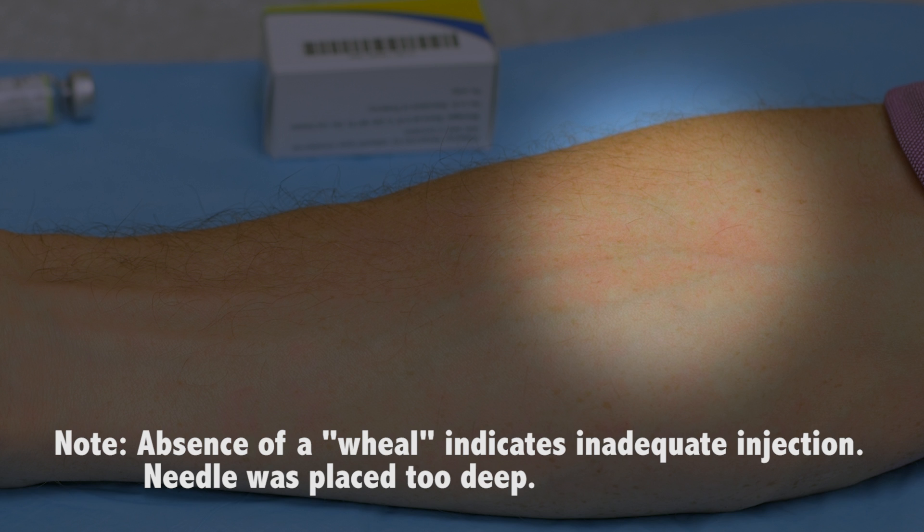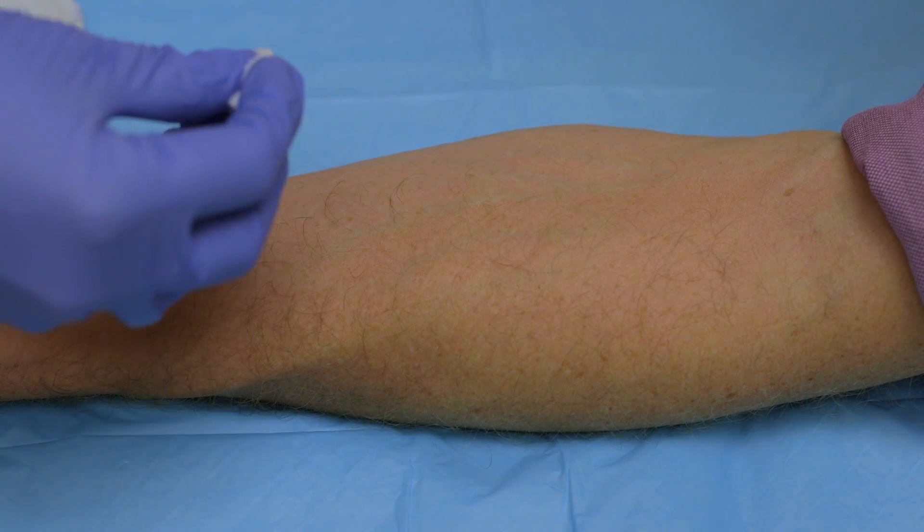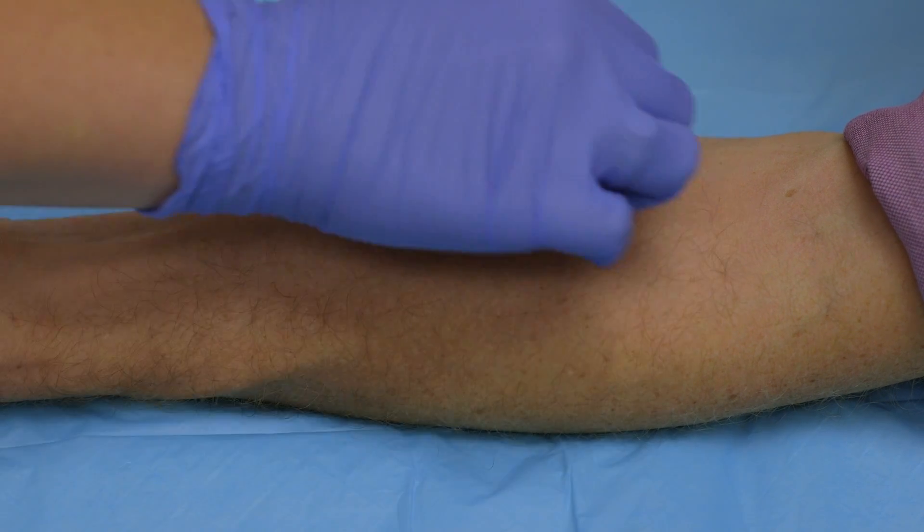Once you inject the medication, if you do not see a wheal, you can either use the same forearm — but make sure you go about 5 centimeters away from the last injection site — or you can switch to the other forearm. We're going to be using the opposite forearm. Make sure that you clean that site in a circular motion.